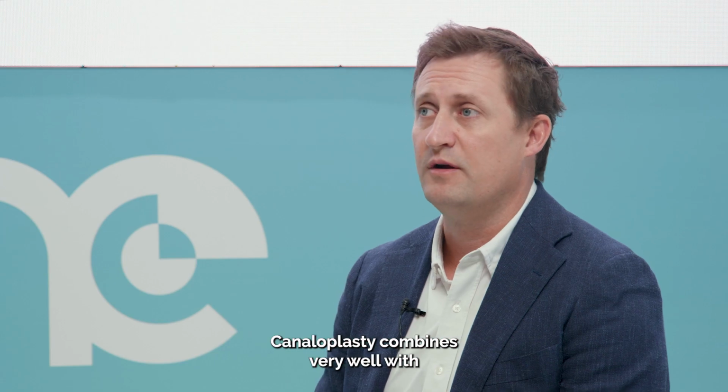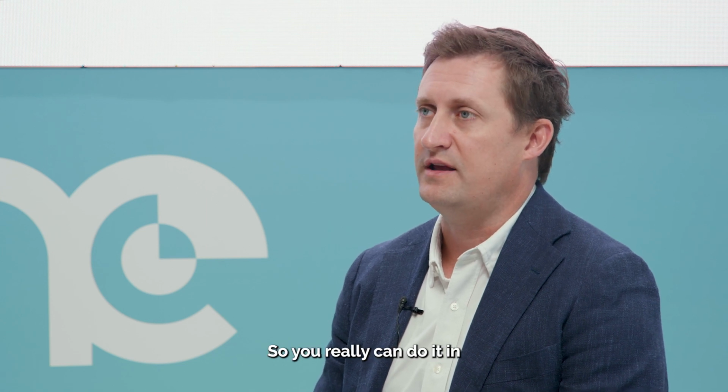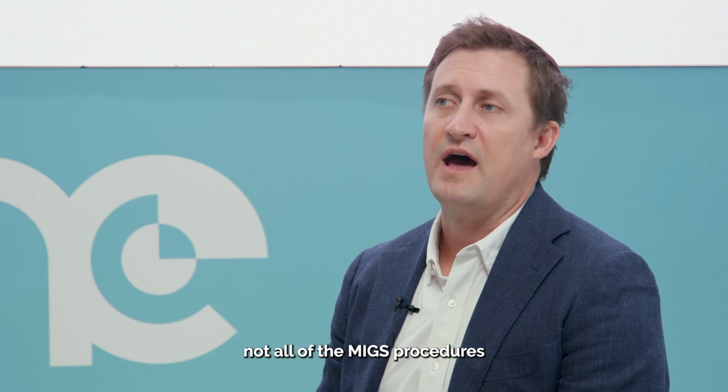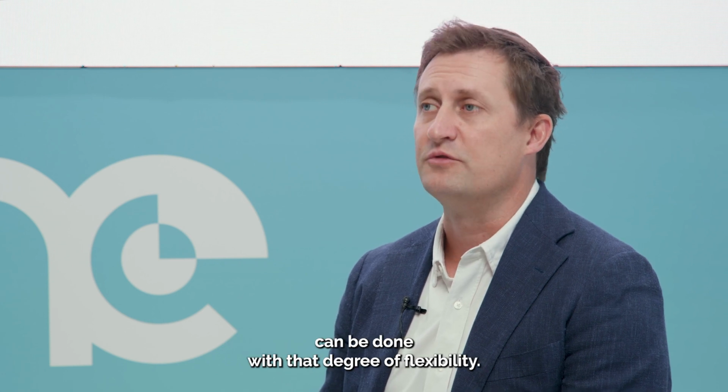Canaloplasty combines very well with cataract surgery as well. So you really can do it in any setting, whereas at least in the United States, from a regulatory perspective, not all of the MIGS procedures can be done with that degree of flexibility.